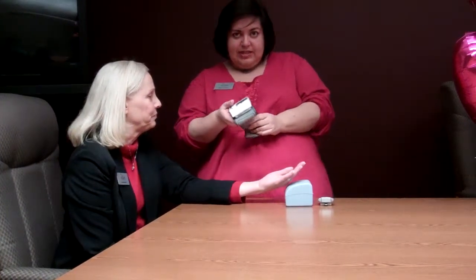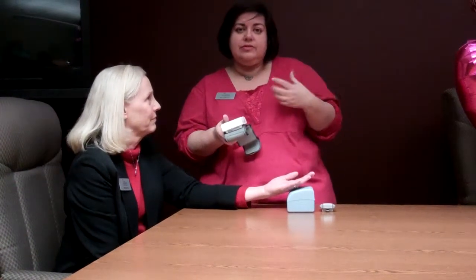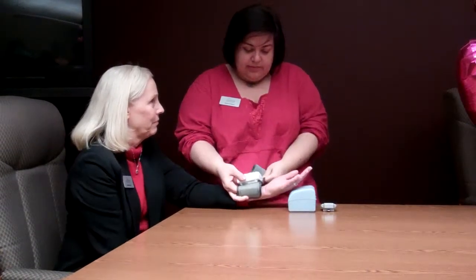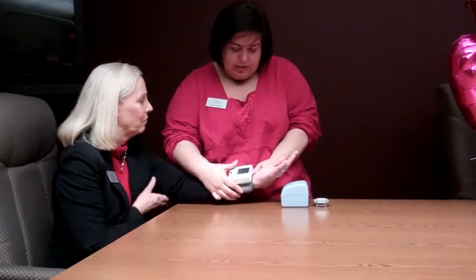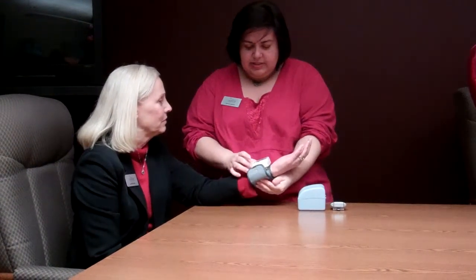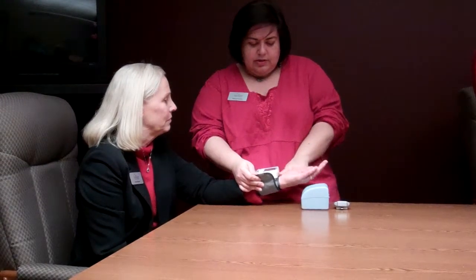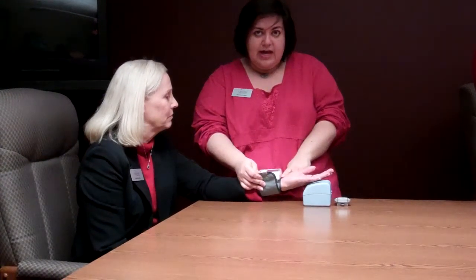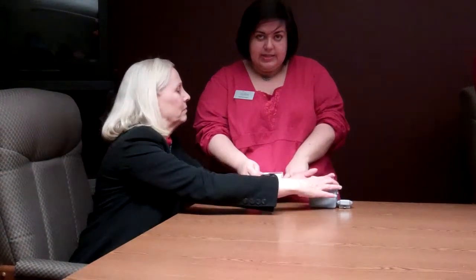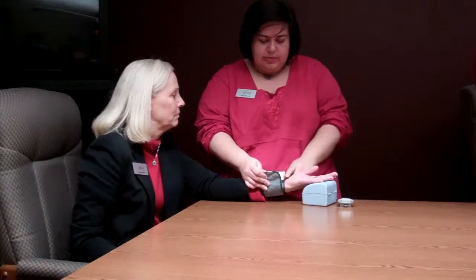When we put this on, it's a wrist cuff rather than an arm cuff because it's meant for you to be able to do on your own to self-monitor. So you would just put it on your wrist like a bracelet, facing up, and you also want it to be a quarter of an inch to a half an inch — you can use a finger to measure — from where your palm ends to where you put the cuff.